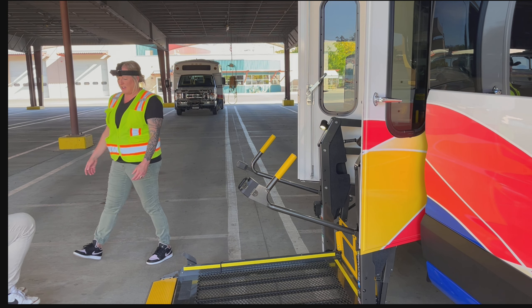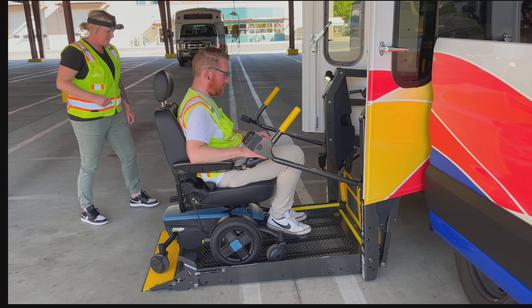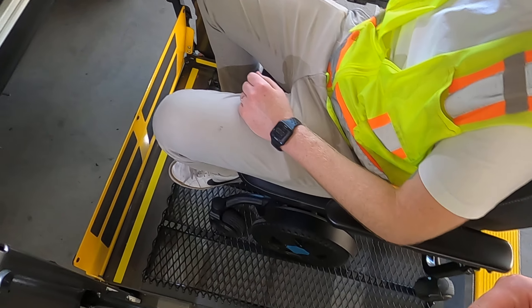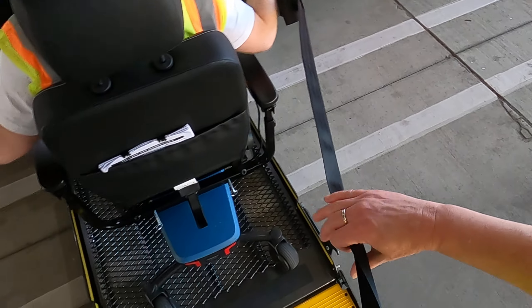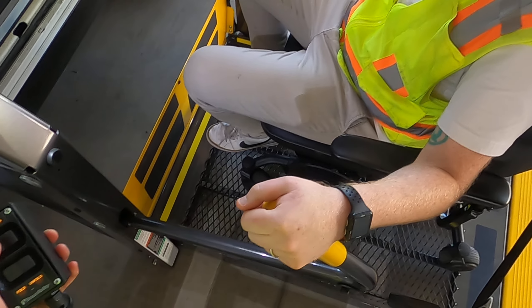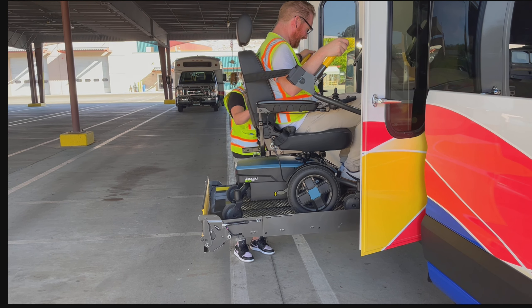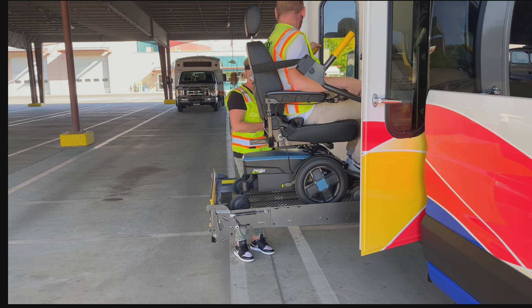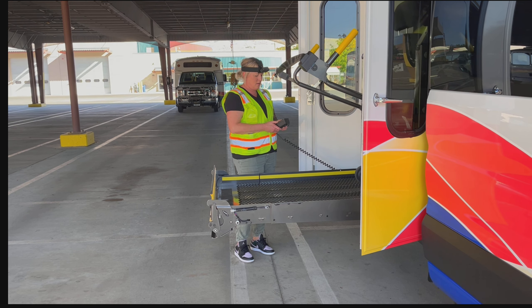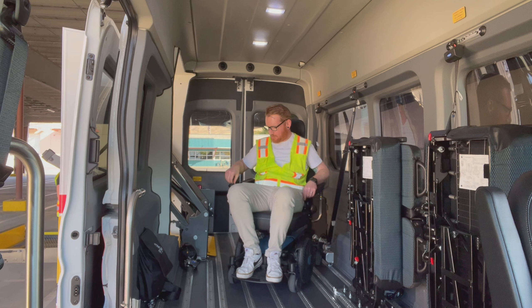My first guest today, Dawson, is using an electric mobility device so he can drive himself on facing the vehicle. I ask him to turn off his power, then secure his belt. I make sure he holds the yellow handles if he's able, and I like to hold on to the chair to give him some added security. I tell Dawson we are about to go up and push up on the lift controller. Now he drives in and positions himself near the front of the vehicle while I stow the lift. Remember to talk through each step of this process with your guests.